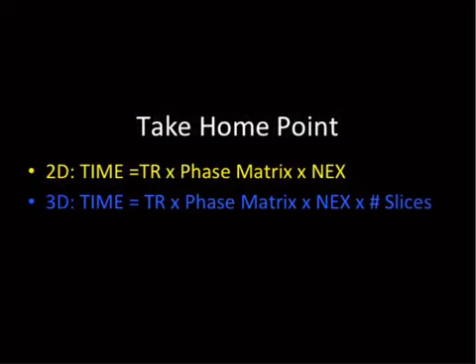Does slice thickness affect scan time? Yes and no. If it's a 2D acquisition, it does not. If it is a 3D acquisition, then it does. For the purpose of multiple choice, I want you to assume always that you are dealing with 2D unless otherwise specified.